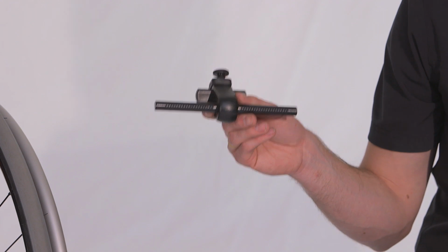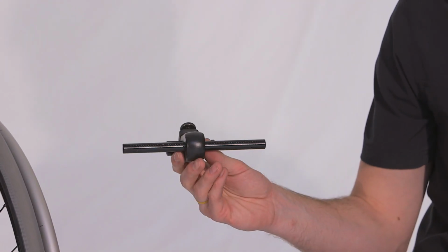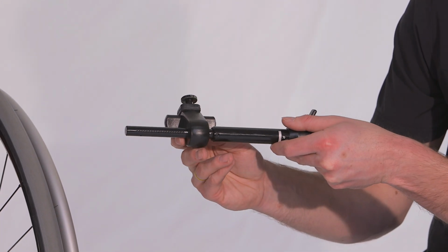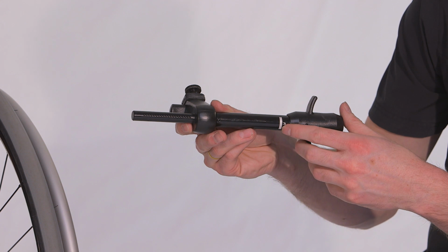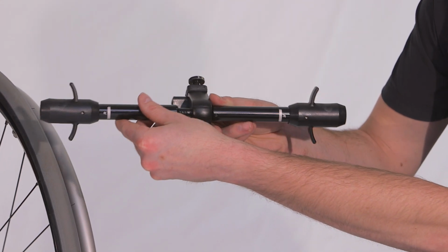So now that you have the correct parts, hold the T extrusions away from you and slide the provided end tubes on each end so that the white stripes are facing towards you. Next, position each of the ends of the adapter bar assembly over each of the quick release axle tips of the wheelchair.